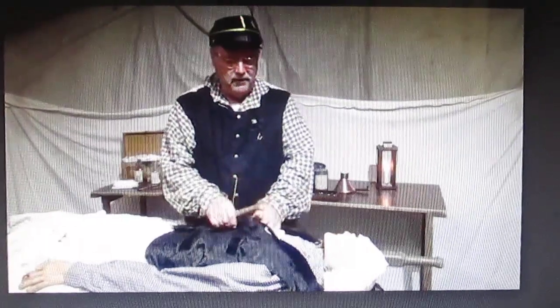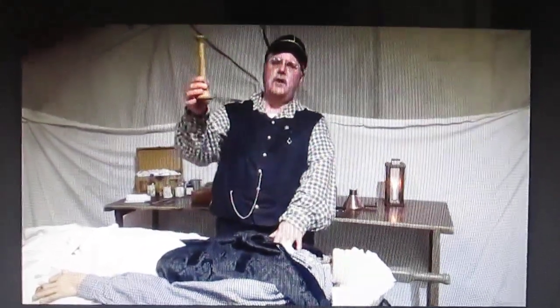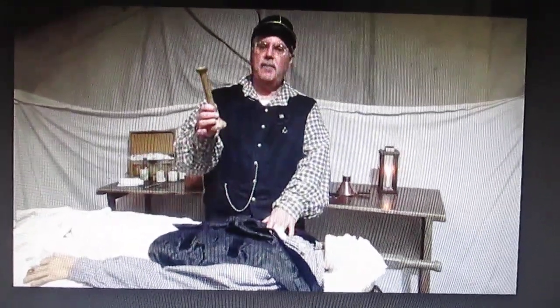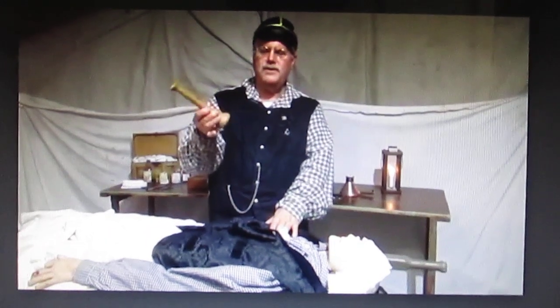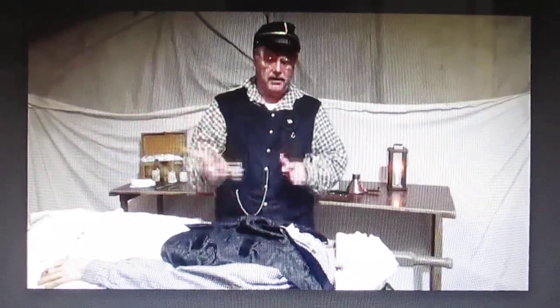So I'm going to move his vest slightly out of the way and open up his buttons, and I'm going to use my stethoscope. Now, this is a monaural stethoscope for one ear. It was actually invented in 1816 by a Frenchman named Laennec. Laennec never patented it, so anybody could make a wooden stethoscope during this time period. We were just starting to have stethoscopes that went in both ears like the ones today, but they weren't widely known, and a wooden stethoscope is far easier to hang on to and less likely to break during the war.